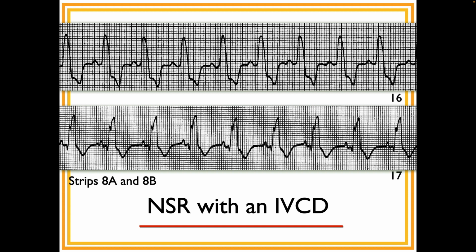Cody, I'm not understanding, how did he identify that there's IVCD? Andrew? Or Koa, you were the one that did it, right? No, Andrew did. Sorry. The underlying rhythm is normal except for the wide QRS. Yeah, it's a wide QRS.